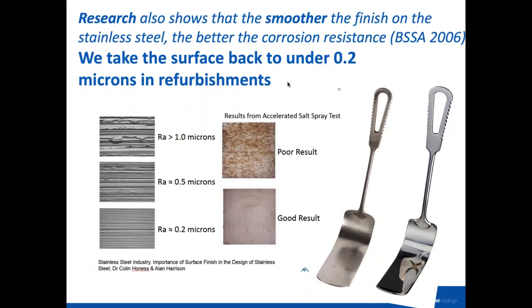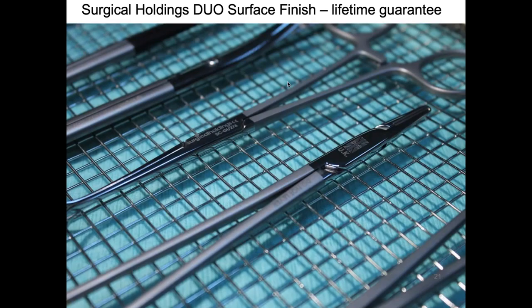but these are microscopic pictures, and it's sometimes not that easy to tell. If you've got a really, really rough finish, you can easily sandblast over it to make it appear to be a nice fine finish. So that's something certainly to remember as well, particularly if you've got variations of finishes of instruments across trays. And it's all to do with the wettability of the device, really. If you've got a rough surface and water droplets on it, the water will not run off as quickly as it will on a smooth surface. So something to think about there.